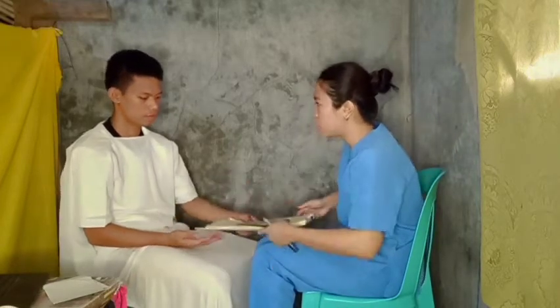So next is to assess the visual acuity with the Rosenbaum card at a distance of 14 inches from the eye. This must be done one eye at a time. Our next tester is the Rosenbaum card, which must be read 14 inches away from you. But since we do not have one, we will be using this pad. So sir, we will be assessing it without corrective lenses. I will just measure the distance and we can start afterward.